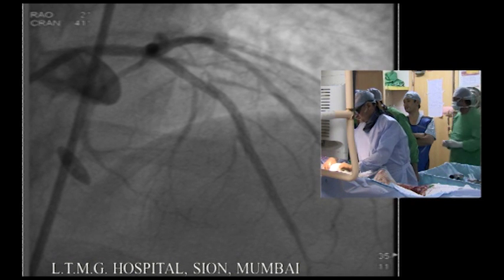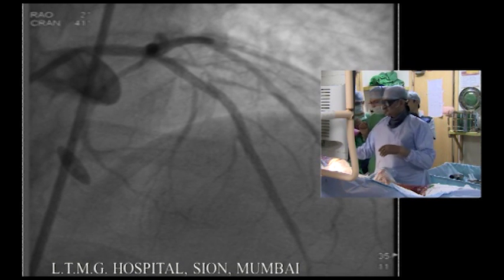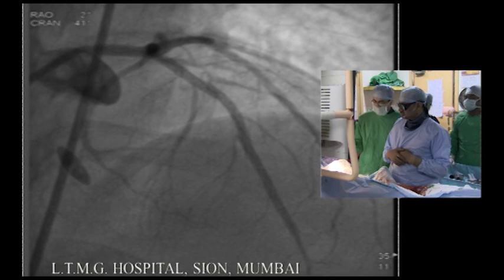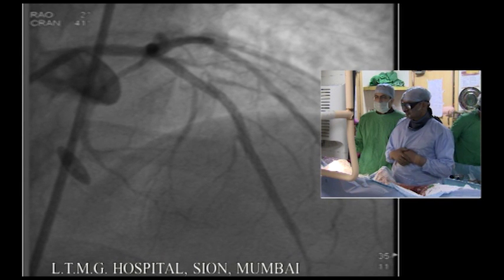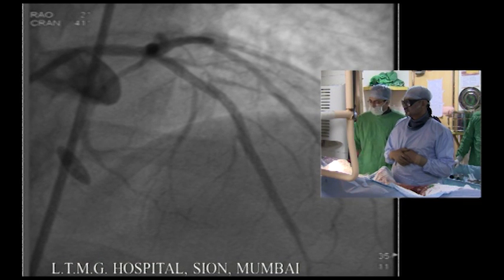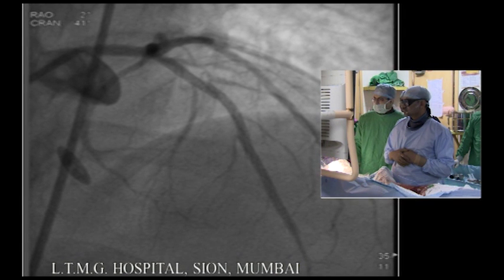I'm going to put everyone on the hot seat. Dr. Chala, what percentage of your patients do you use IVUS or OCT in your cath lab? I generally agree for IVUS in this case. Most cases we use IVUS. Only in some bifurcation cases we use OCT. And you, what percentage of your cath lab patients undergo IVUS?